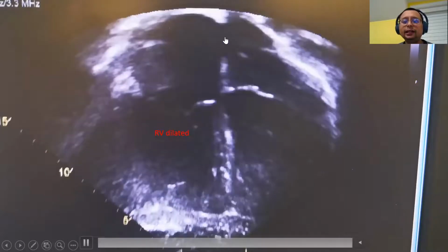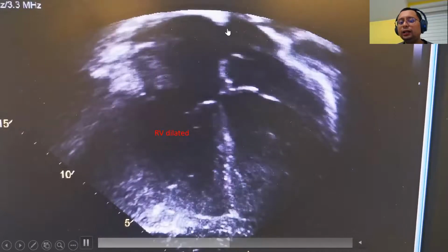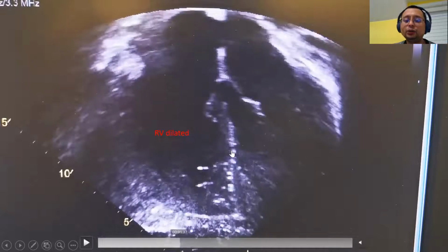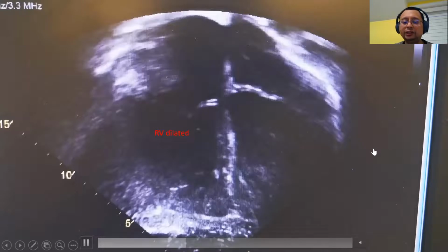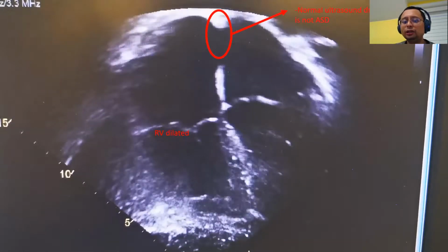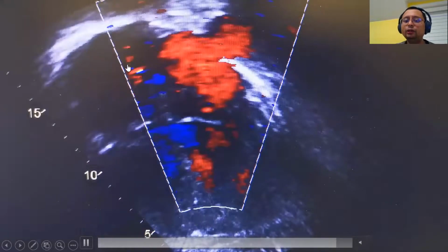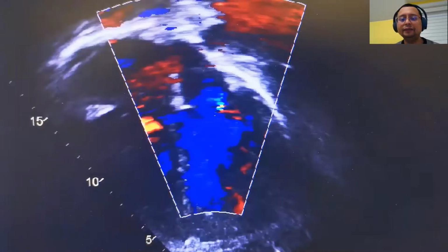So you might think that this is actually an atrial septal defect. But remember, whenever this is parallel to the angle of insonation, you can have susceptibility to echo dropout. So make sure that you actually demonstrate with color. This patient actually does not have an atrial septal defect there. That is where normal ultrasound dropout occurs, so that is not an atrial septal defect. Again, I put a color and I can demonstrate that there is no color flow from the left atrium into the right atrium. I still don't have an answer why my patient has right-sided heart dilatation.